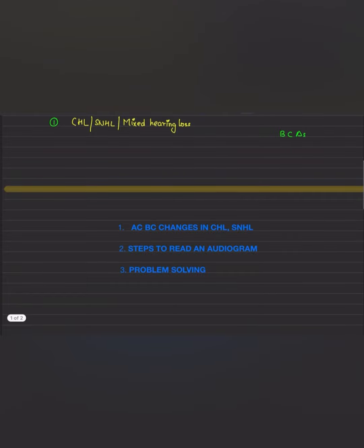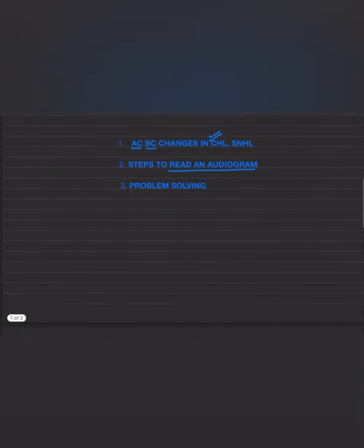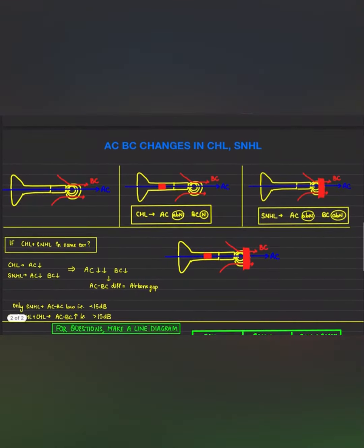In this video, first we'll discuss what changes of air conduction and bone conduction occur in different types of hearing losses. Then we'll study some basic steps to read an audiogram, and then we'll solve some problems of audiogram to get a good grasp over it. The first topic is the air conduction and bone conduction changes in conductive hearing loss as well as sensorineural hearing loss.